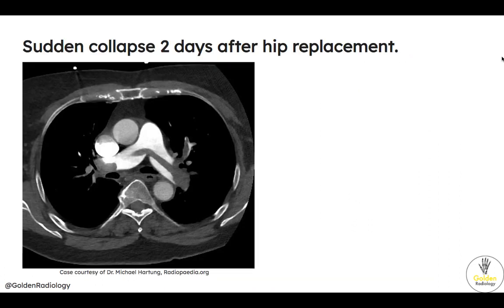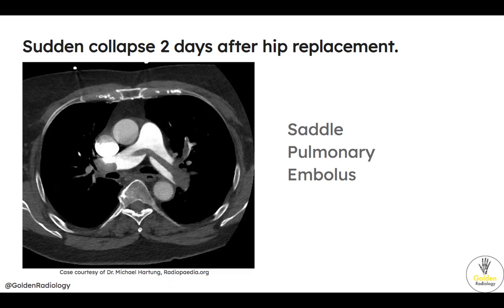Next question: sudden collapse two days after hip replacement — shown is this CT image. Diagnosis? This is a saddle pulmonary embolus. We're looking at a CTA of the chest, most commonly ordered to evaluate for pulmonary embolism. We time our contrast bolus so we scan when contrast is opacifying the pulmonary arteries. This is the main pulmonary artery, dividing into the right and left pulmonary arteries. Contrast is bright white, so this dark stuff represents clot. We have a saddle pulmonary embolus because the clot is sitting right at the bifurcation into the right and left pulmonary arteries.